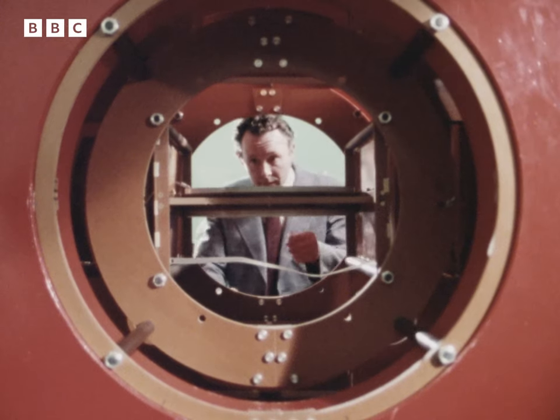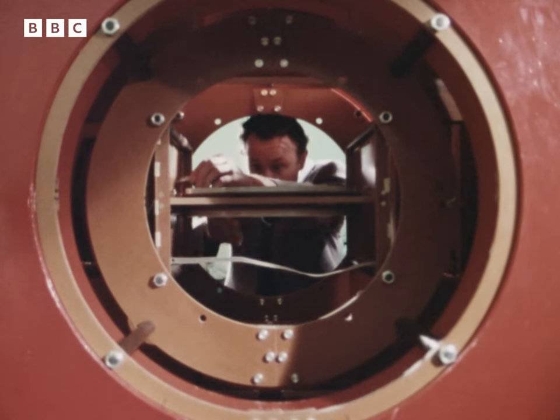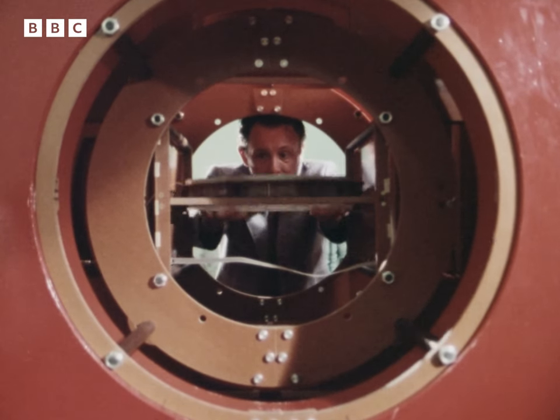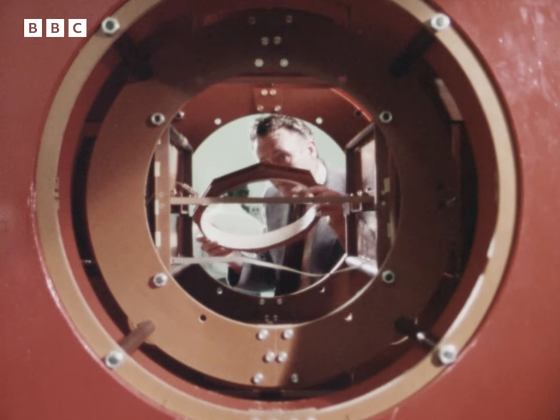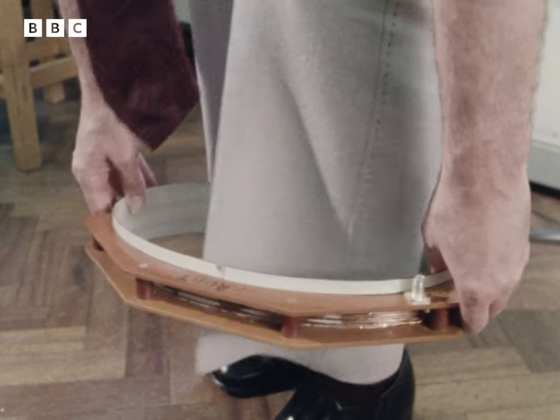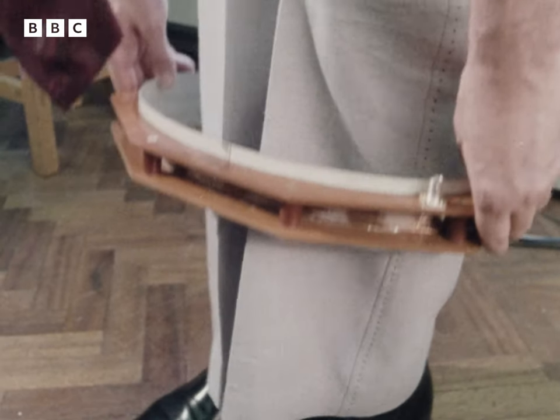Three years ago, using smaller magnets, Dr. Mansfield managed to take a picture across the inside of a finger. Now he's constructed this monster magnet, big enough for him to build up pictures anywhere inside the human body. The guinea pig for the first test was Dr. Mansfield himself.